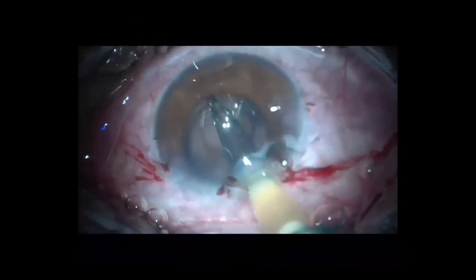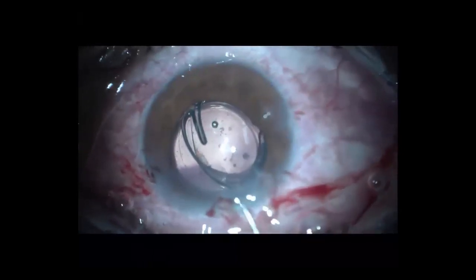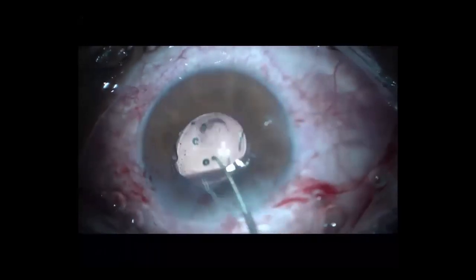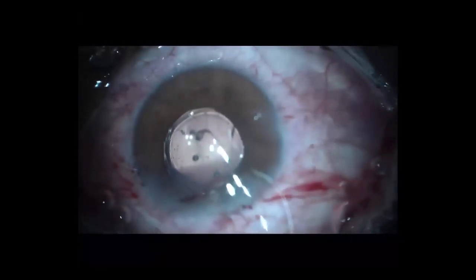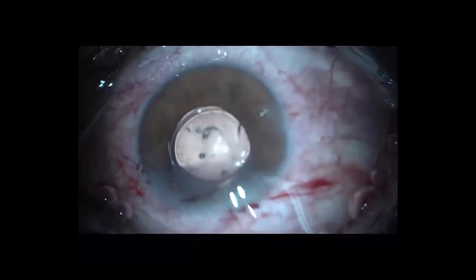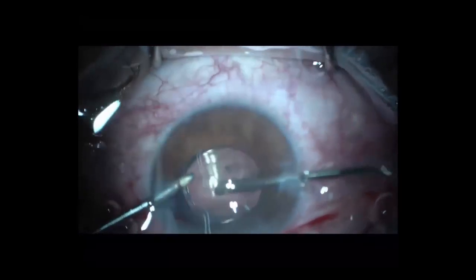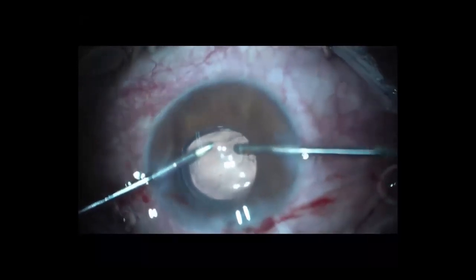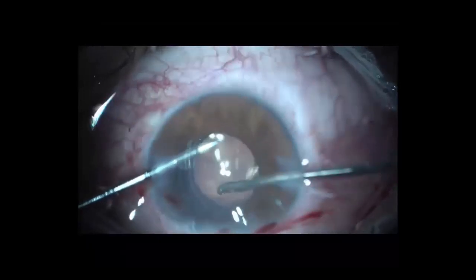It's easy to misplace the second lens, so you have to be very careful to put it in the bag, because there is another lens inside the bag. You can easily misplace your second lens and put it in the sulcus, and being an acrylic hydrophilic, it will definitely be decentered. So in order to achieve proper centration with overlapping of both lenses exactly opposite each other and coaxially, you have to place the second lens and be sure that your lens is in the bag. Once you have achieved this, you can remove all the viscoelastic that is remaining from inside the eye, and the procedure is then concluded.